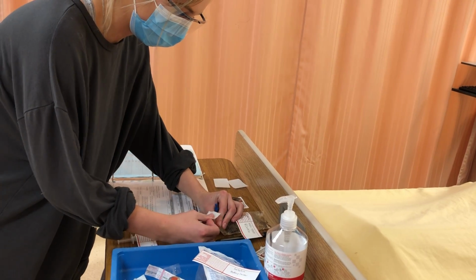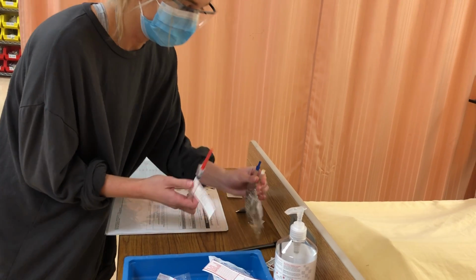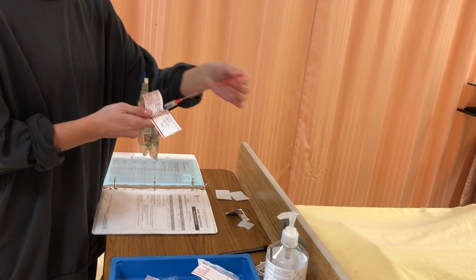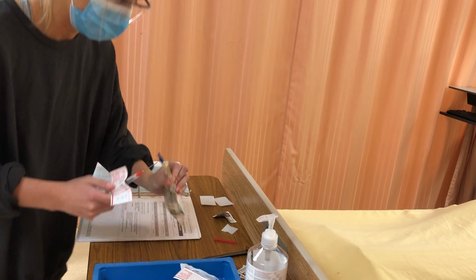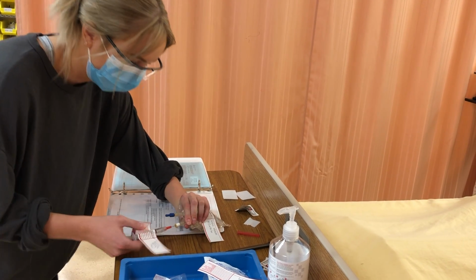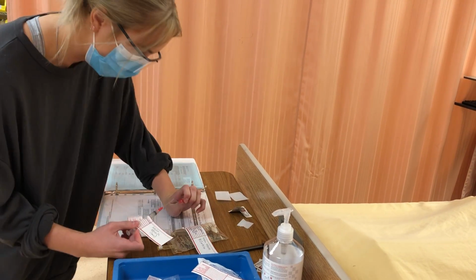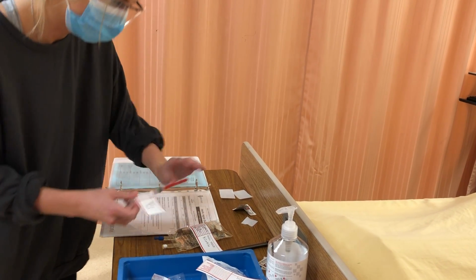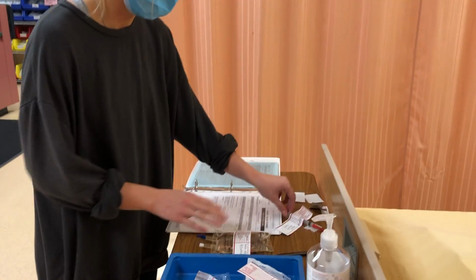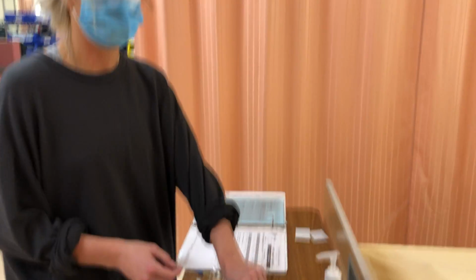So I'm just going to clean the port for 30 seconds, let it dry for 15. Making sure we're staying sterile. And then I'll inject that medication into there. And I'm going to gently rotate the bag. So this now has my nurse's signature on here. So now I can get ready to go to the patient's room.